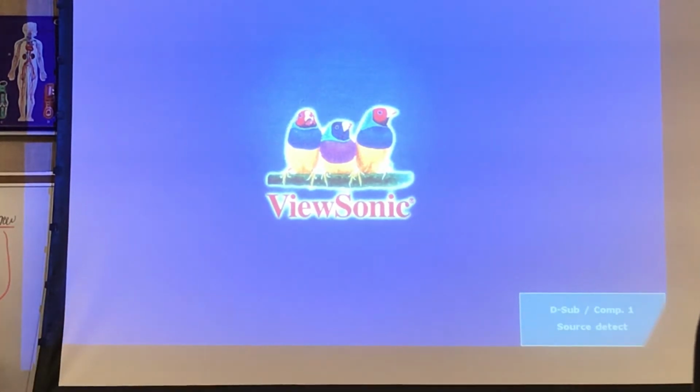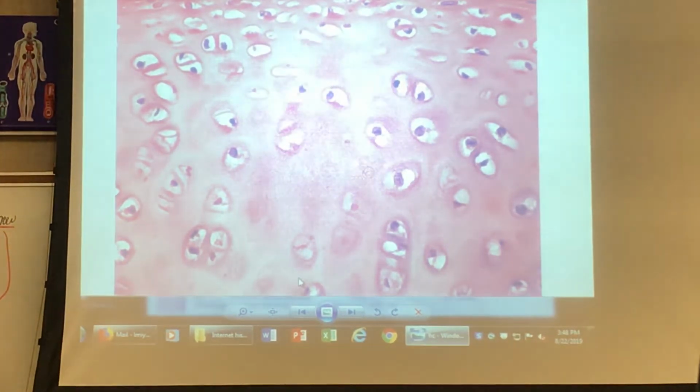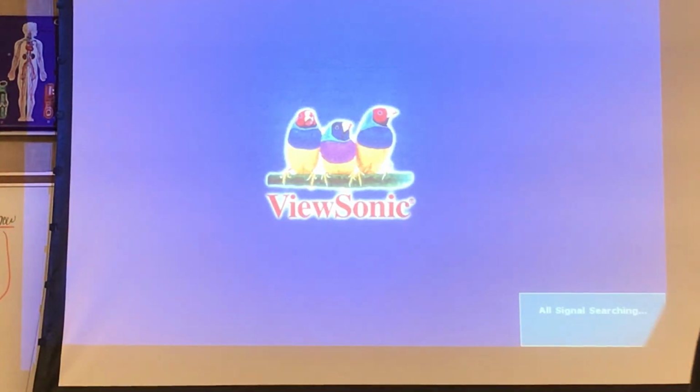You see a basement membrane and a free surface? You see cells separated by stuff? Do you see lacunae? Yes. Do you see fibers or do you see jello? This is hyaline cartilage. See how my questions are just going in order, even if I already know the answer, I'm asking the same questions. Everybody look at me. That is what it means to be systematic. You take nothing for granted, you ask the same questions. Let's move on.